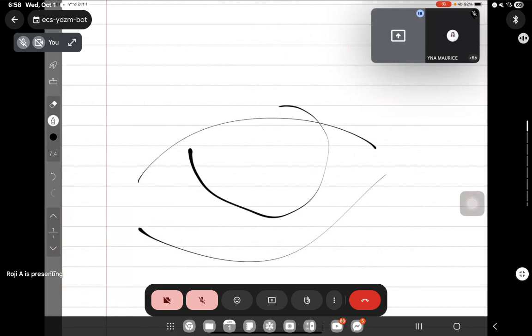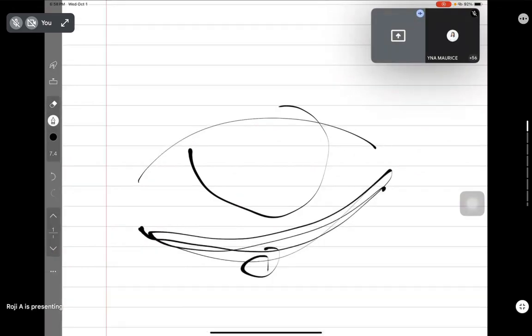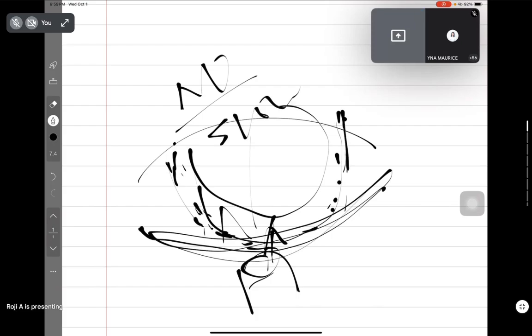So if you are looking up, and this is the lower lid, what you do is with your thumb, push it up, and that would touch the contact lens. You check whether it's too tight, you would notice it's not moving much. But if it's loose, it moves a lot. It moves fast. So it's either no movement, slow, or fast. Clear so far? Yes po. Okay, good.